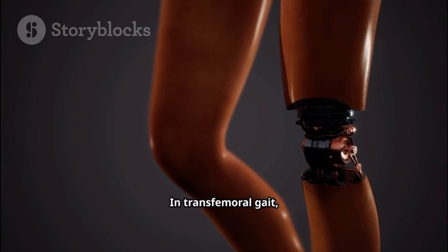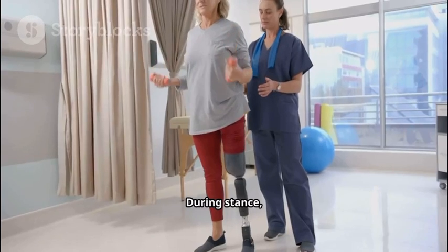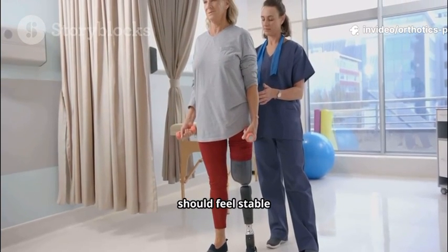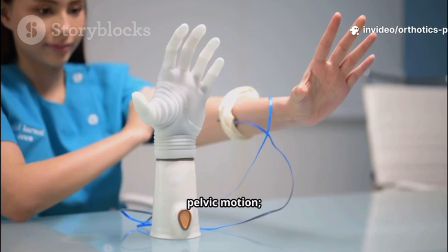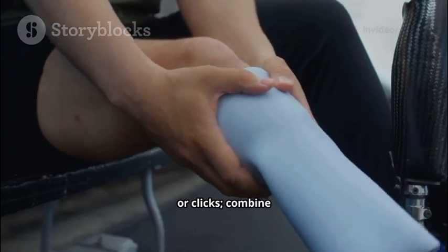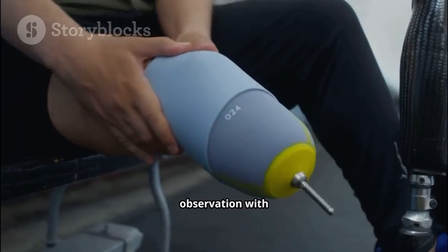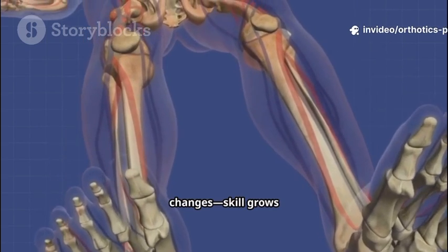In transfemoral gait, monitor swing control and avoid terminal impact. During stance, the prosthetic knee should feel stable and inspire confidence. Observe trunk and pelvic motion. Length issues can drive compensations. Listen for squeaks or clicks. Combine objective observation with patient feedback. A comprehensive analysis guides adjustments and therapy changes.